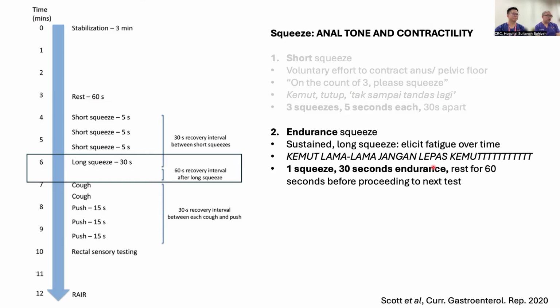And anorectal manometry will be very useful in order to understand the pathophysiological mechanism underlying that so-called defecatory problem. Because by understanding this, we can institute appropriate treatment. For example, if the patient has defecatory issues, biofeedback is a really effective therapy. If you look at studies, if you institute it in an appropriate patient, there is a 70 to 80% chance the patient can improve.